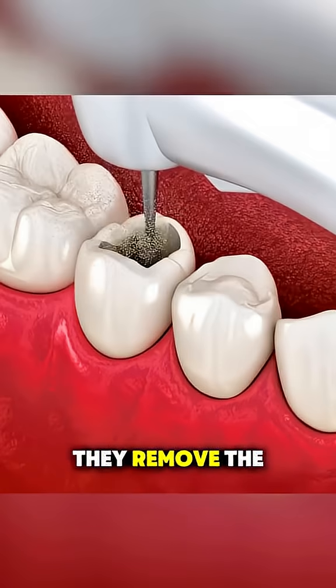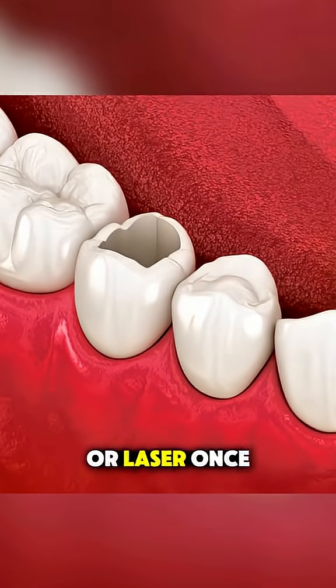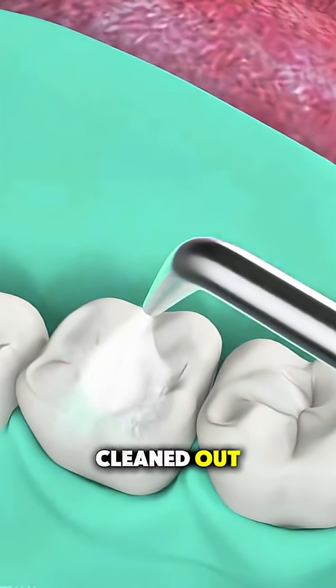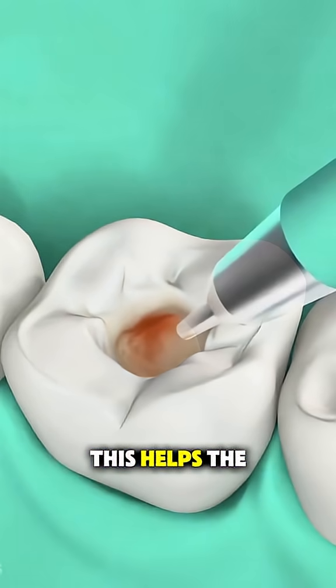Then, they remove the decayed or damaged part of the tooth using a drill or laser. Once the tooth is cleaned out, they apply a special gel to roughen the surface. This helps the filling stick better.